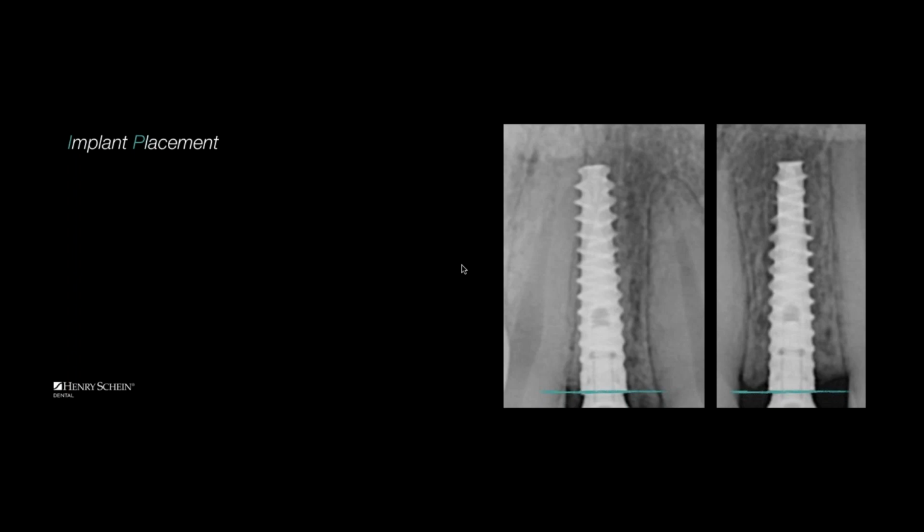So if I take a zirconia abutment and I make it thin, a narrow diameter because it's a 3.0 diameter dental implant, I put a hole through the middle of it for a screw and start banging on it sideways, function, they don't perform very well. They have a higher incidence of fracture. So we know industry-wide, it is not a good idea to make zirconia abutments for 3.0 diameter dental implants. So now I'm scratching my head. I need a white abutment. I can't use zirconia. What can we do?